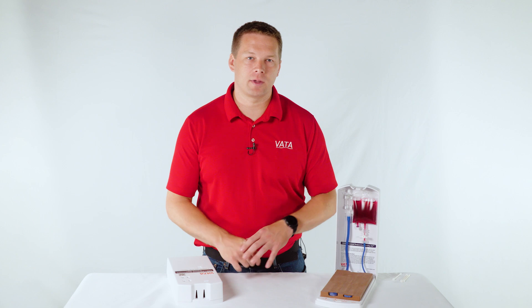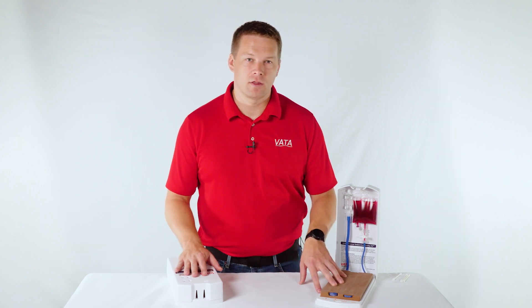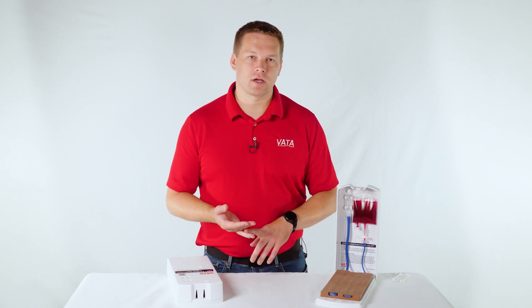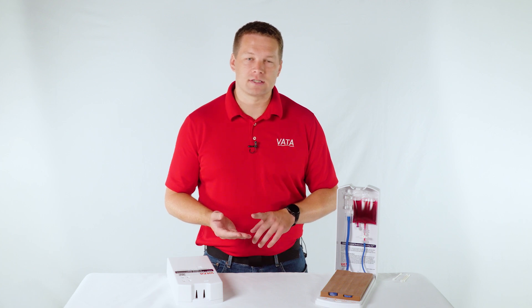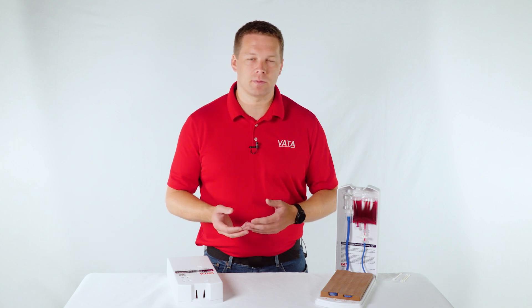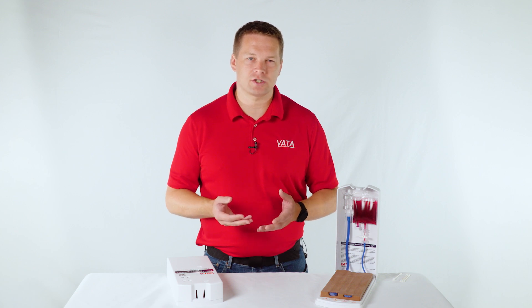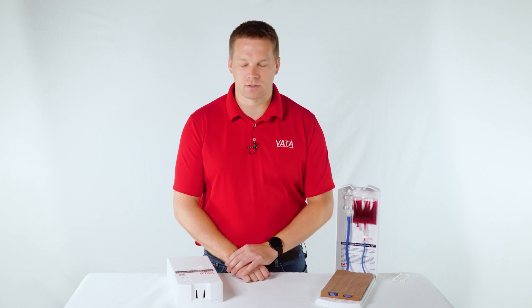Hi, I'm Andrew with Vata and today I'm going to be going over our 2365 and 2366 models. These are our advanced venipuncture models and today I'm going to go over a couple of different things on them: how to set up the model and get it ready for use, the different features on it, replacement parts, and the frequently asked questions and care of the model.